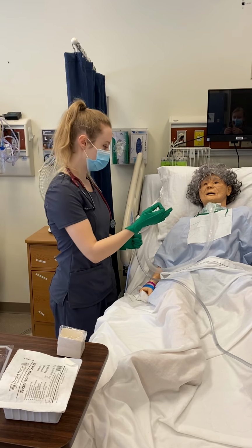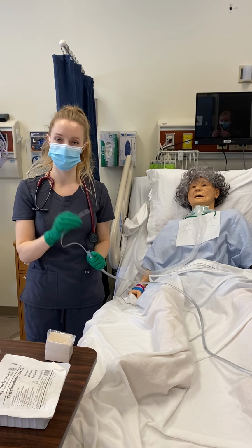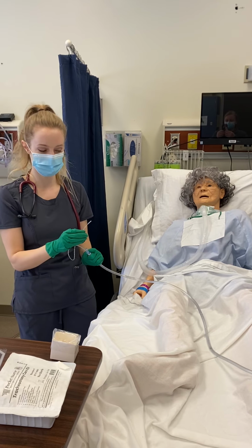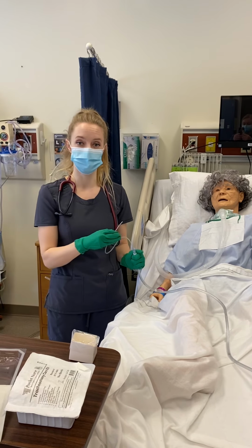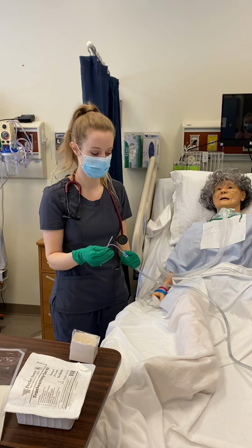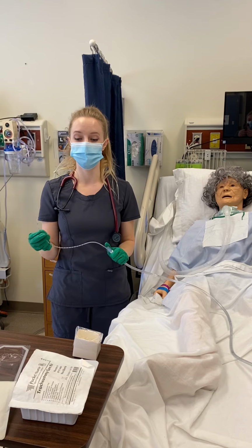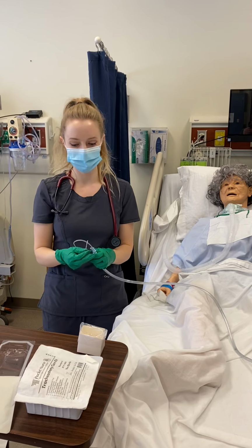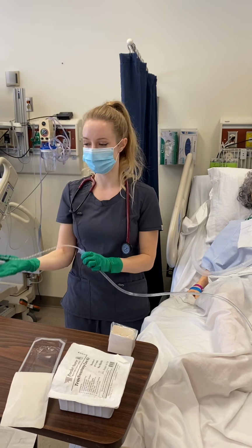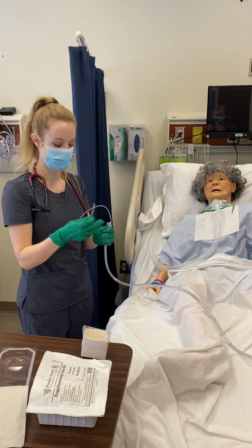I will ensure that my patient's oxygen saturations are good before I turn the oxygen back down to the pre-hyperoxygenation level and turn my suctioning off and ensure that there's equipment for the next person that suctions at the bedside. For the sake of this video, I'm going to go into tracheal suctioning. Normally I would have a new catheter and I would be reestablishing my sterile field and re-donning gloves, but for the sake of this video, I'm going to just demonstrate here.